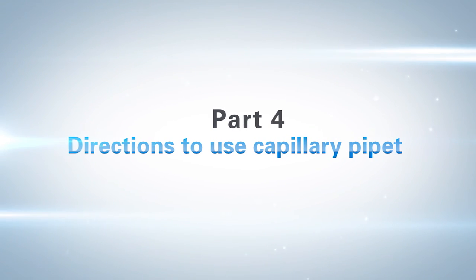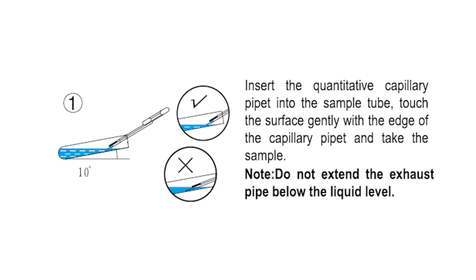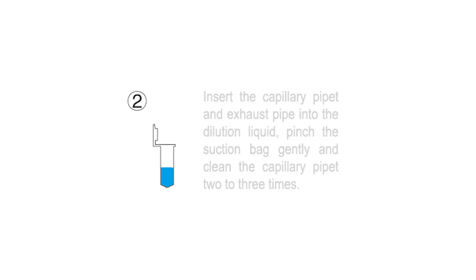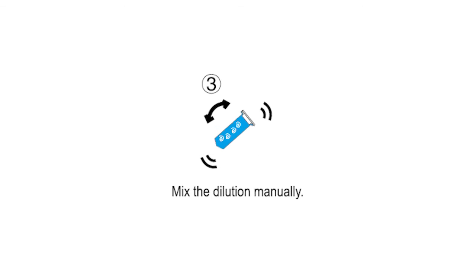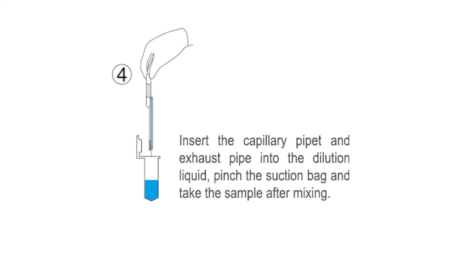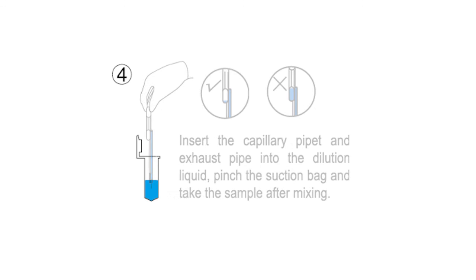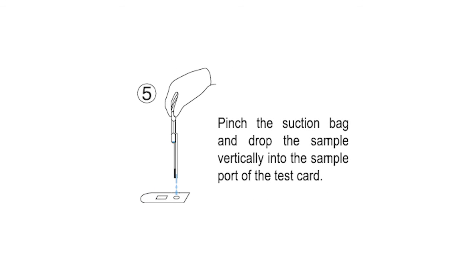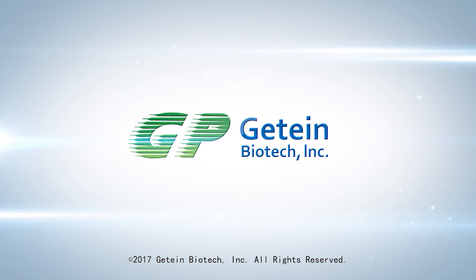Part 4: Directions to use capillary pipette. Insert the quantitative capillary pipette into the sample tube and touch the surface gently with the edge of the capillary pipette to take the sample. Note: do not extend the exhaust pipe below the liquid level. Insert the capillary pipette and exhaust pipe into the dilution liquid, pinch the suction bag gently, and clean the capillary pipette two to three times. Mix the dilution manually. Then insert the capillary pipette and exhaust pipe into the dilution liquid, pinch the suction bag, and take the sample after mixing. Pinch the suction bag and drop the sample vertically into the sample port of the test card.